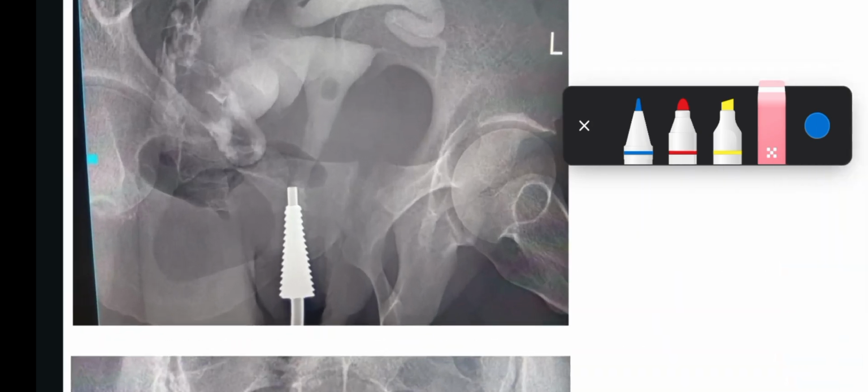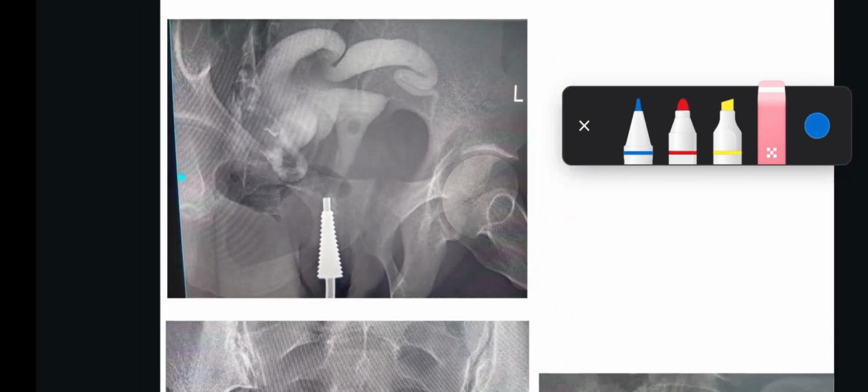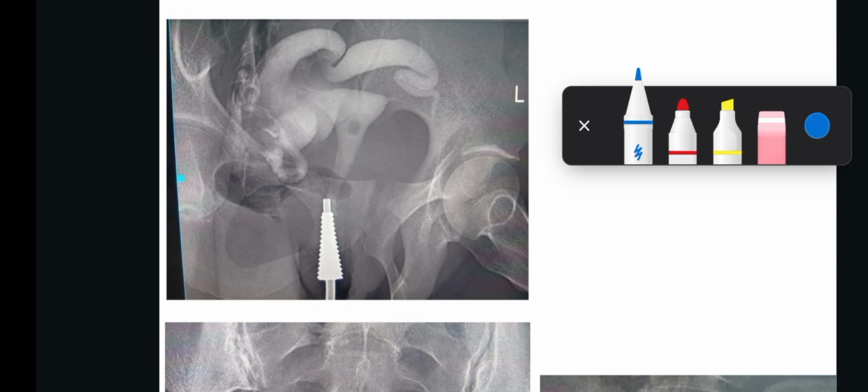Then we'll see this case here. Yeah, this is an interesting case. This is a case of hydrosalpinx. Yeah, we see the cervix here, and we see the womb shown. We see this tiny dark spot there. We call it a filling defect. That could be air or fibroid. Then we see this tiny line that moves out of here, and this big loop.